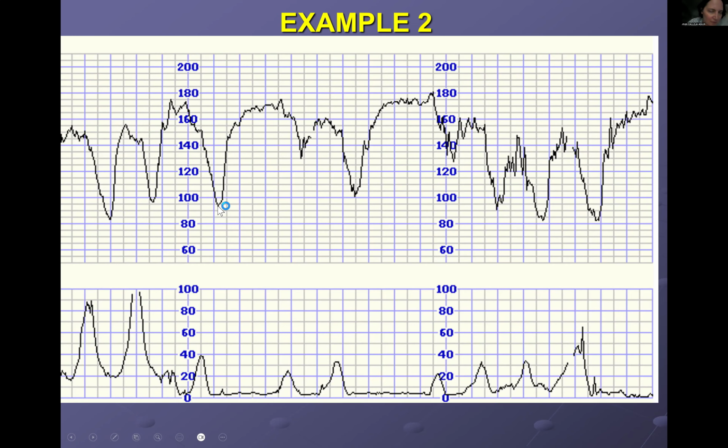And mind you, even if we were to mistake that, it's still bradycardia. But of course, if they take the baseline rate as being 90 or 100, and then think that these are accelerations, that is the biggest mistake ever that can be made. So well done, Philip. The baseline rate is 170. Is that normal?